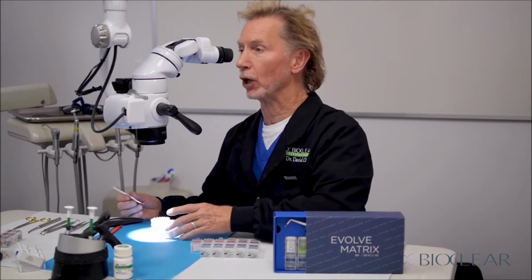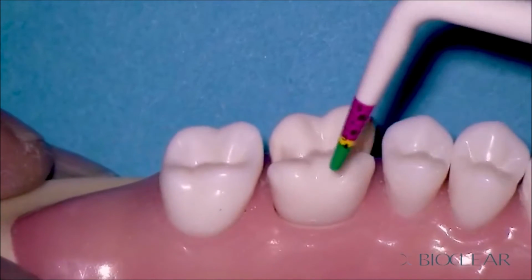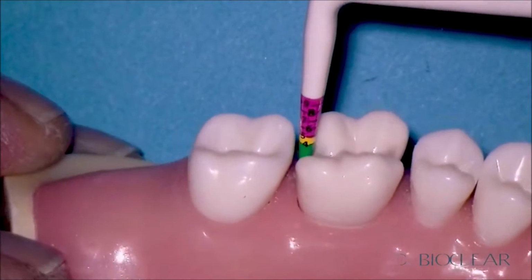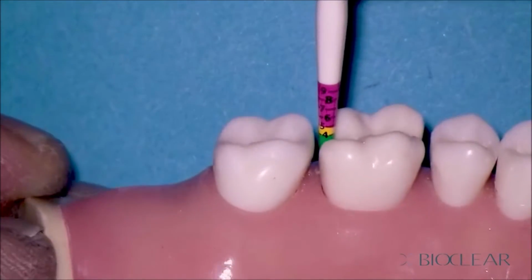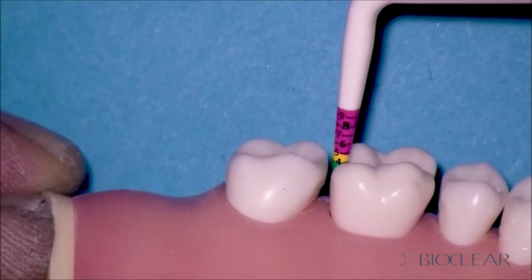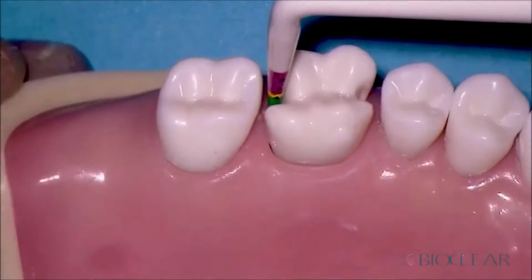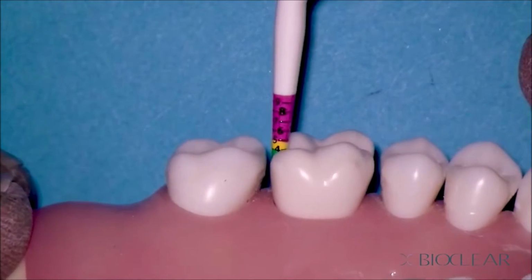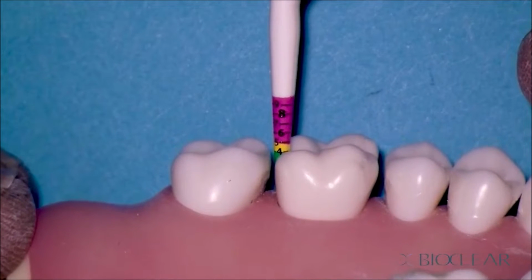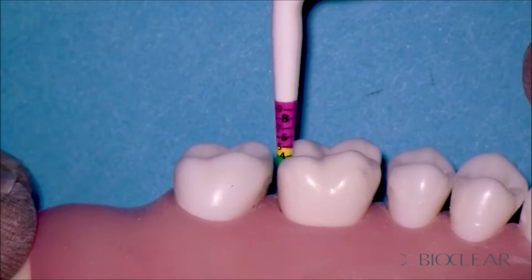So once we've finished the cavity preparation, blasted, we're ready for injection molding, we want to go ahead and drop the matrix height indicator into the cavity preparation. I'm going to look from an oblique angle, and you're going to want to take a look at the marginal ridge of the neighboring tooth or the shoulders or cusps of the tooth that we're going to be restoring. So in this particular case, when we look at the distal, we can see that it's about 4 millimeters. And this also overlaps with the go, no go coloration.